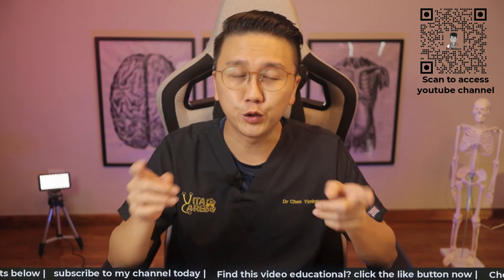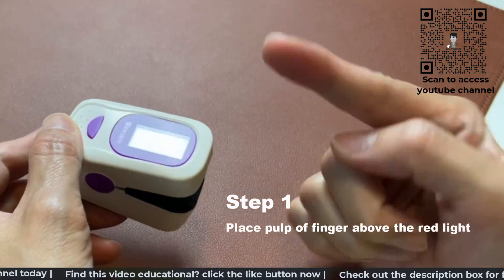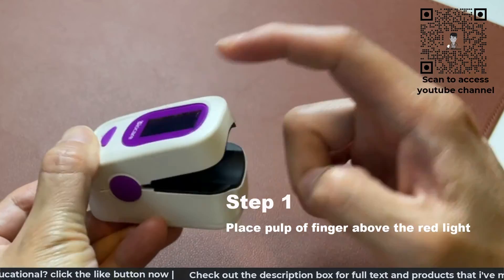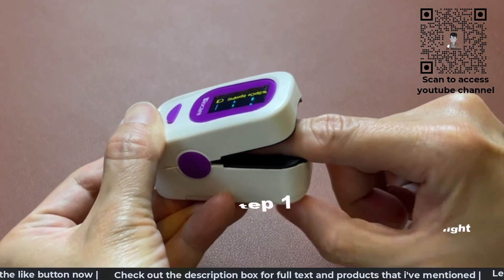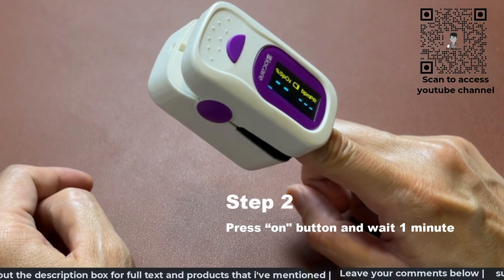Now I'm going to show you how to use the pulse oximeter. Step one, place the finger into the clip, making sure that the middle part of your finger is directly above the pulsating red light. Step two, press the on button on the device and wait for about a minute for the readings to stabilize.